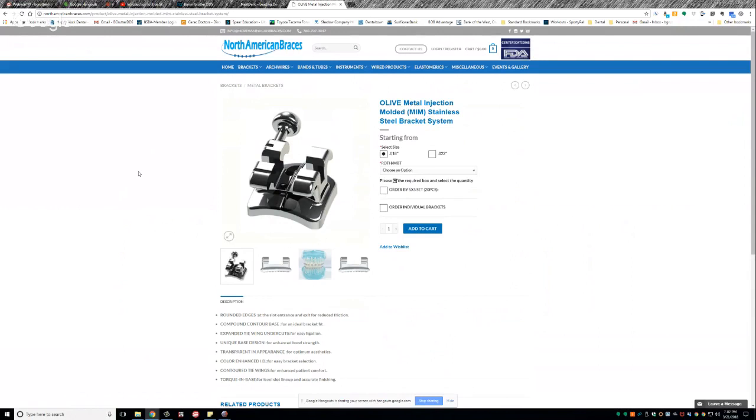Okay. There are a couple more questions. Let's just do one last question regarding the Formlabs flexible resin. Do you have any experience with that? Yeah. They have two resins that would look outwardly appealing. One is the flexible, and one is the durable. Flexible I wouldn't use at all. It's gray and it crumbles, it cracks. It's not a bad resin, but not for what we use.